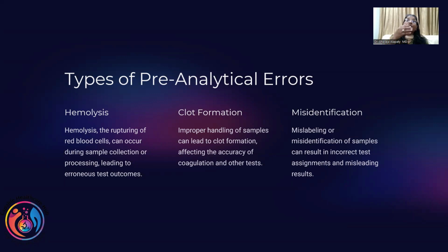And that is when you have to look into the histogram in the system. Just one small mistake: you have a sample, they have not mixed it properly immediately. Microclot formation. If they've not mixed, it means a big clot, which you can make out. What you can't make out is the small one, but that also we can make out by the histogram.